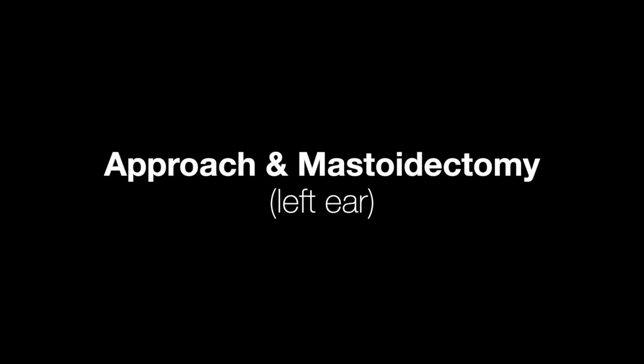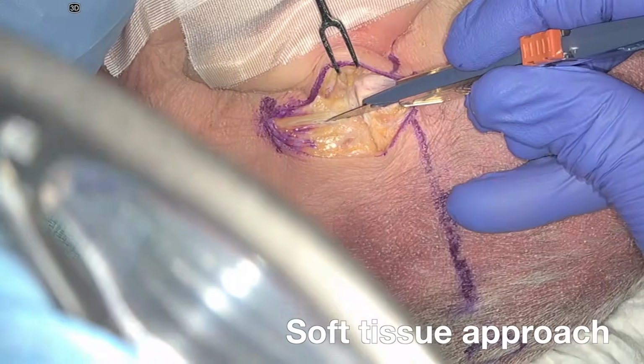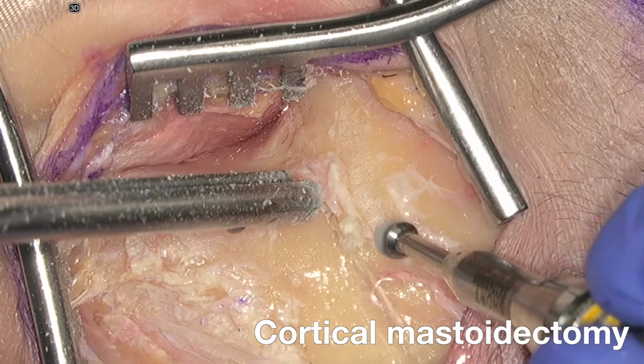Let's do a quick overview on the surgical procedure for cochlear implantation before we get into actual electrode insertion. For greater detail on the surgical approach, see my How to Mastoidectomize video. This is a left ear. We start with a skin incision and then make a T-shaped palva flap before drilling.